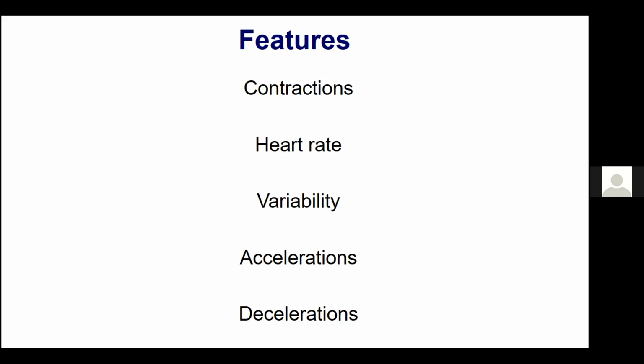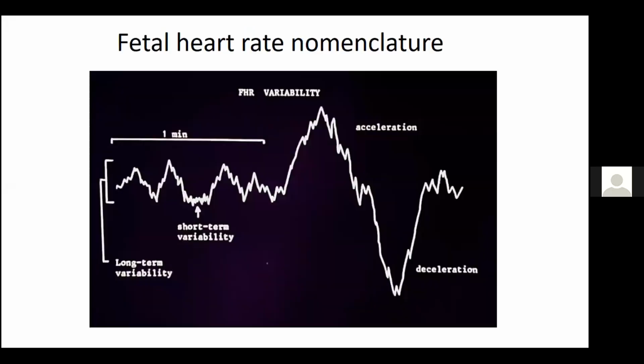So going forward, you pay attention to accelerations mostly when you are doing an antenatal CTG. Intrapartum, we do not focus on accelerations. They're not even used in the assessments, because when a patient is intrapartum, it's very rare to see accelerations. But if you are doing an antenatal CTG, it is absolutely crucial that you see accelerations on the trace to know that the baby is well.